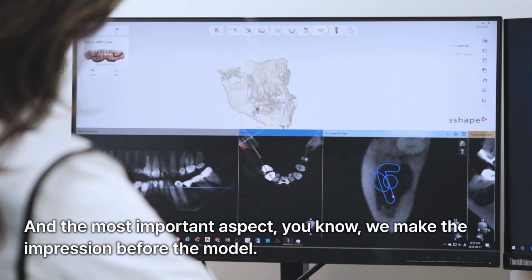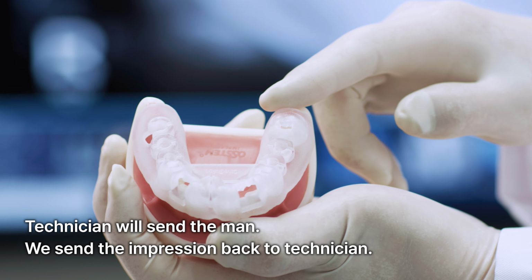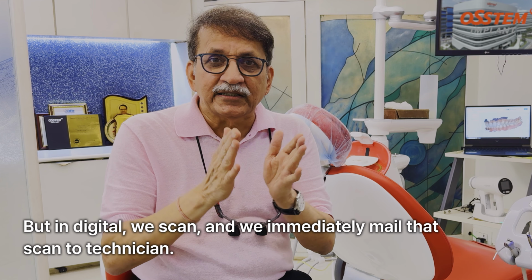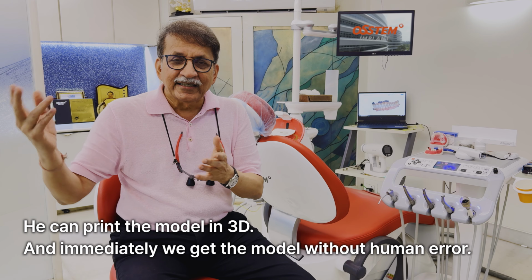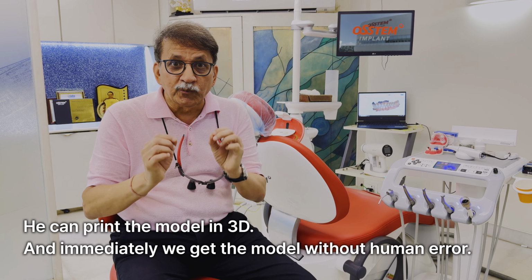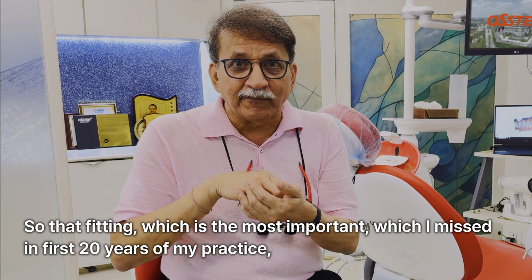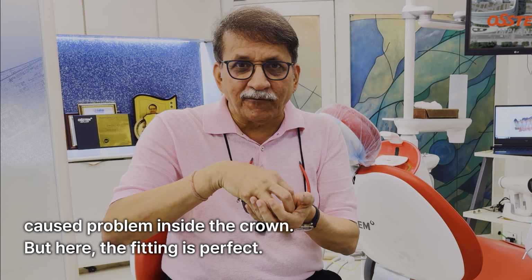And the most important aspect: we make the impression, we pour the model, the technician sends their man, we send the impression back to the technician, they pour, there is a problem in the pouring, and human error comes into construction, etc. But in digital, we scan and we immediately mail that scan to the technician. He can print the model in 3D and immediately we get the model without human error. So that fitting, which is the most important, which I missed in the first 20 years of my practice, which caused problems inside the crown, here the fitting is perfect.